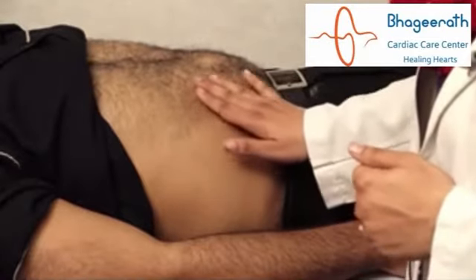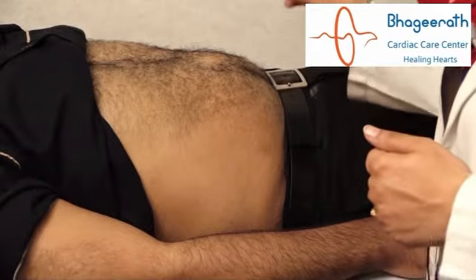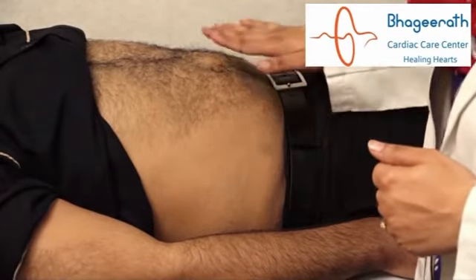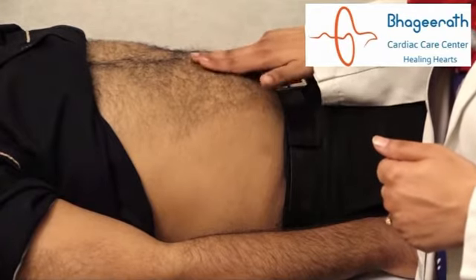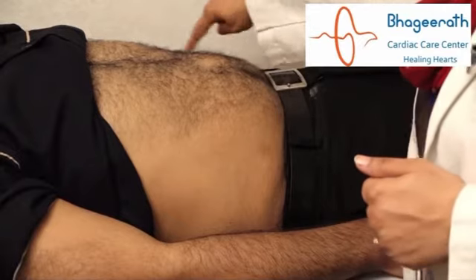Because the abdomen contains a lot of subcutaneous fat, the insulin is injected into the subcutaneous fat. So you should always tell your patient to inject the insulin keeping 2 fingers away from the navel on both sides, and all the area of the abdomen can be used to inject the insulin.